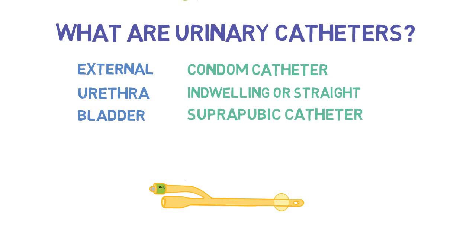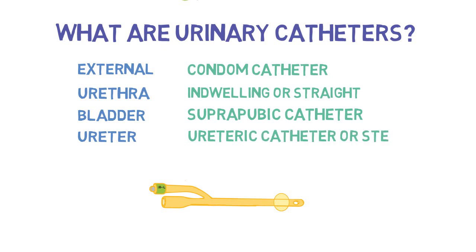A catheter can be inserted into a ureter. This is rarely seen outside the operating room. Commonly, you might see a ureteric stent. If the catheter is directly connected to the kidney, it is referred to as a nephrostomy tube. This can either be done open or percutaneous. The term Foley comes from the designer Frederick Foley, a surgeon working in Boston, Massachusetts in the 1930s.